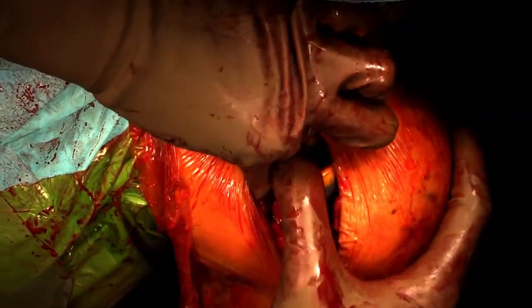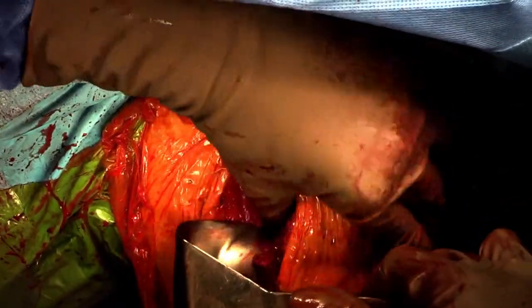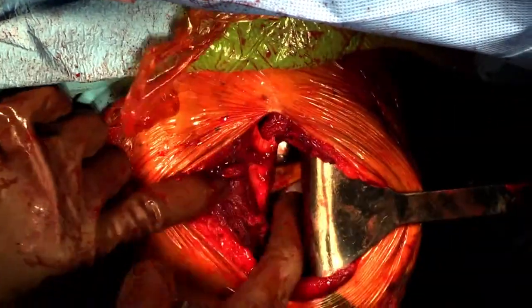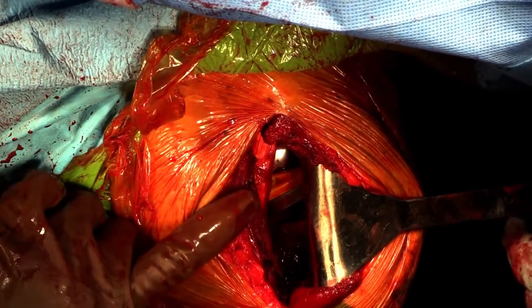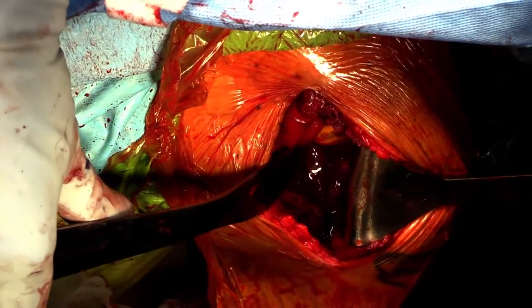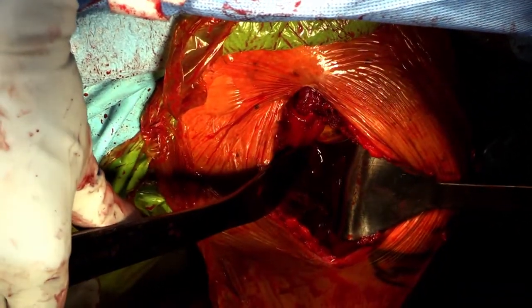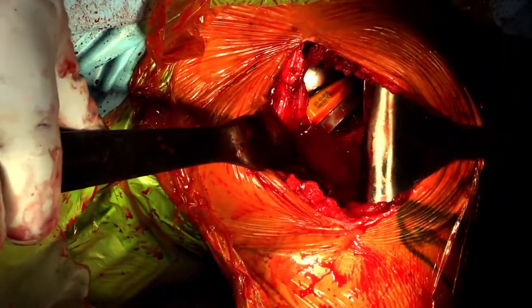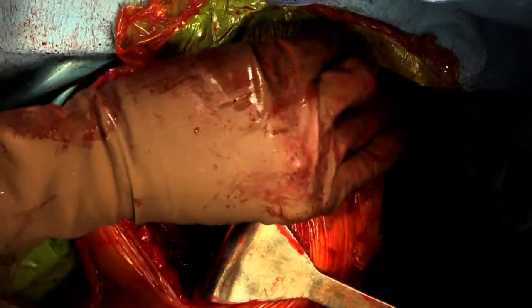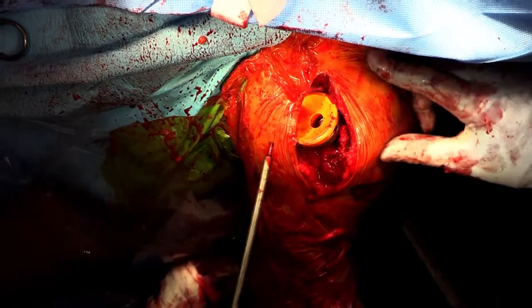In this case, you can see the surgeon fighting against the conjoined tendon. This will require the surgeon to retract the tendon while applying pressure on the arm. Check for stability and place the arm in extension and internal rotation. The humerus is then dislocated and the trial is removed.